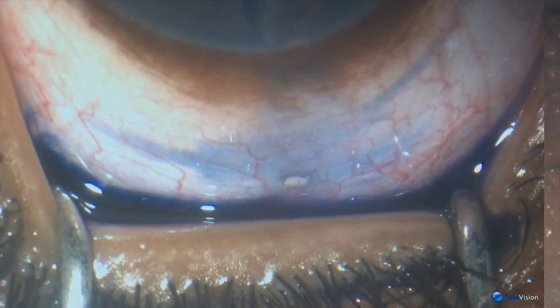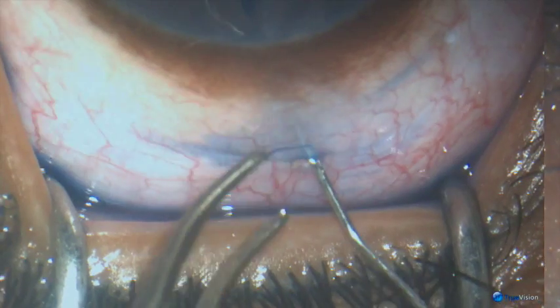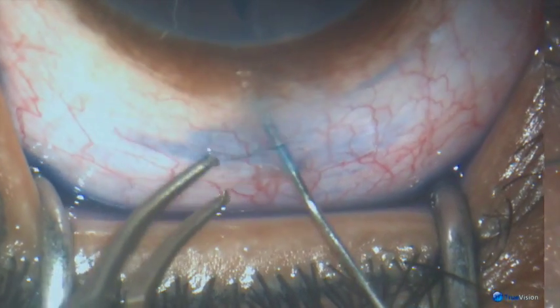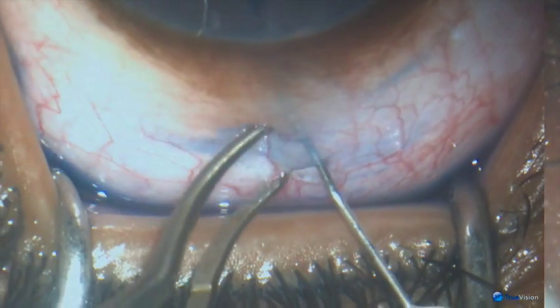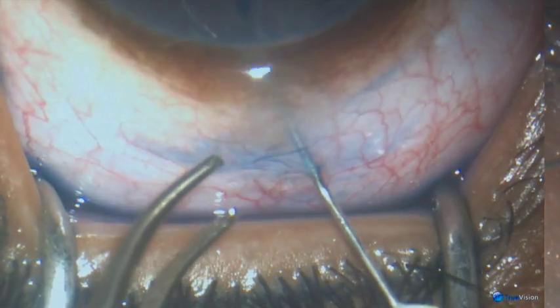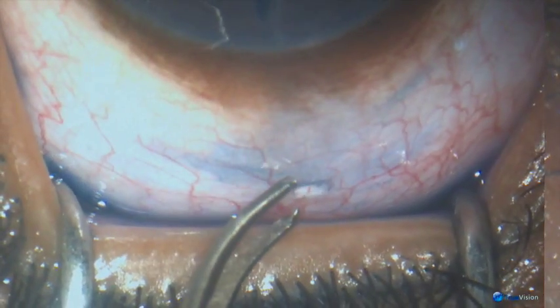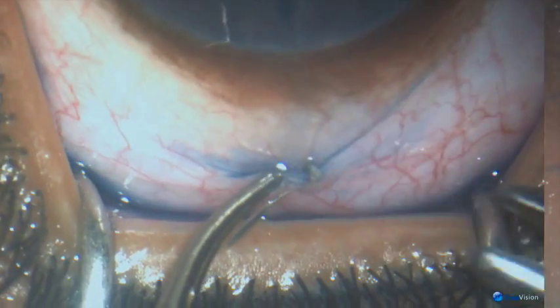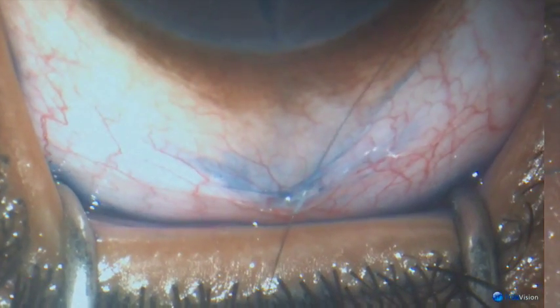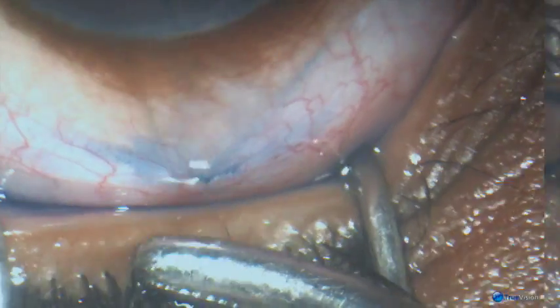Then I inject cross-linked sodium hyaluronate on the outside of the filtering track. It prevents adhesion formation between the conjunctiva and the underlying tissues, which probably helps in the success of the surgery. One suture closes the opening in the conjunctiva.